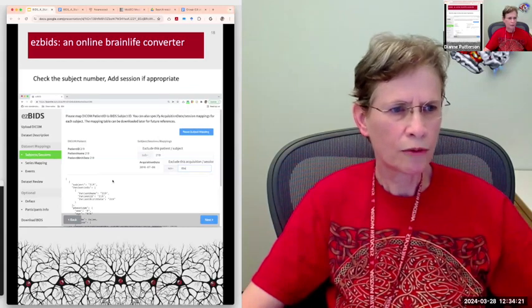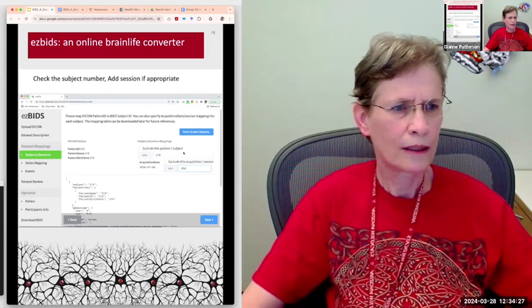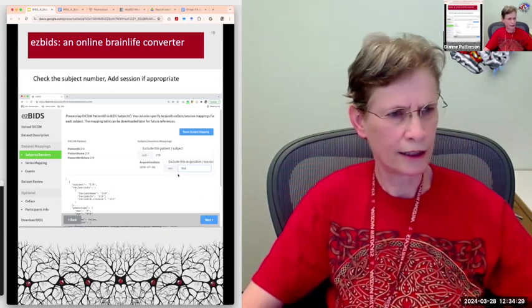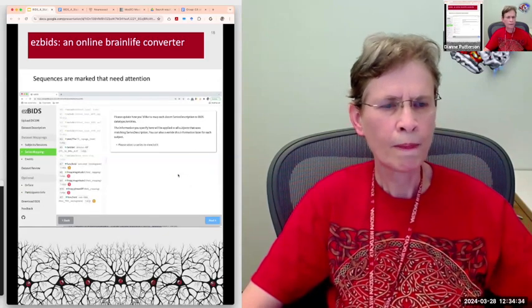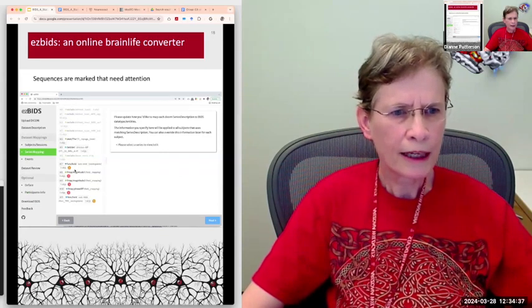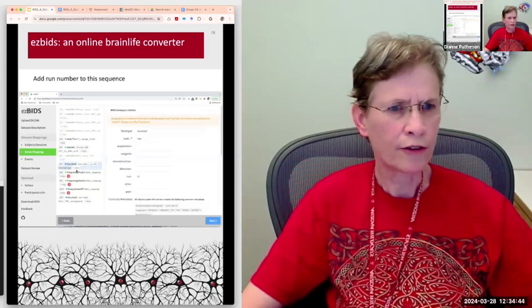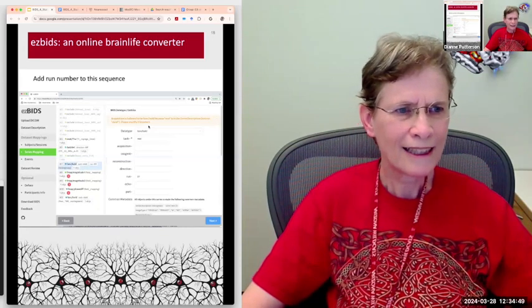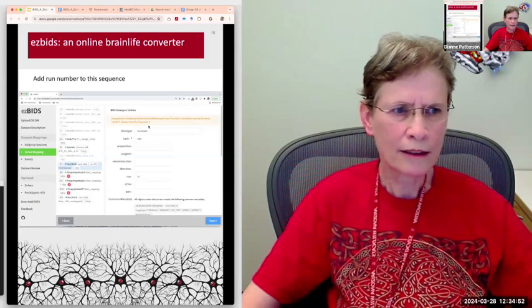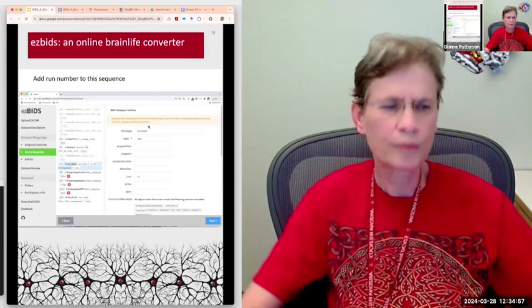It's going to ask you how you want to name your subjects. And so you can tell it in here that I've got a session and what I want to name that. And then it's going to do the series mapping thing where it identifies fields, sequences where it has questions for you and it wants you to verify. So here we look at this first one, the func bold, and it says it thinks this is a bold because there's the word rest in there in the series description, but it wants you to confirm that that's right.